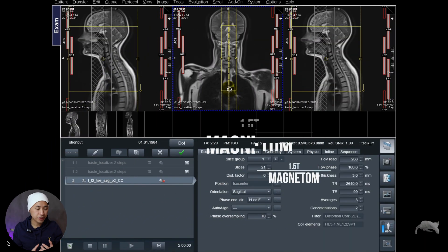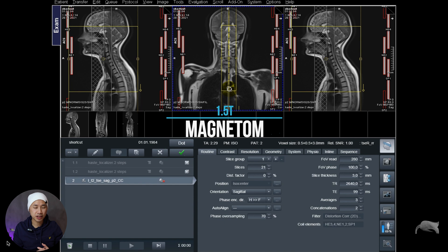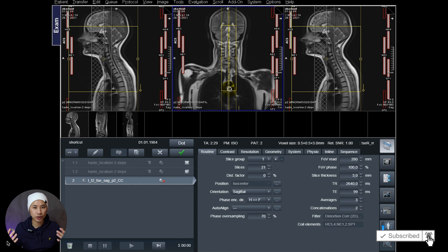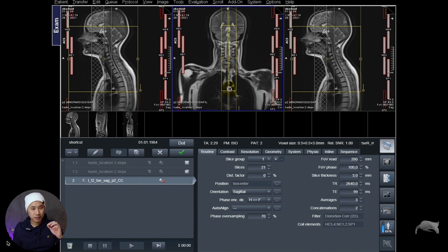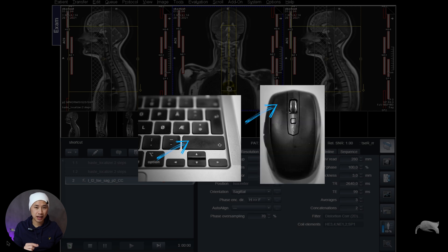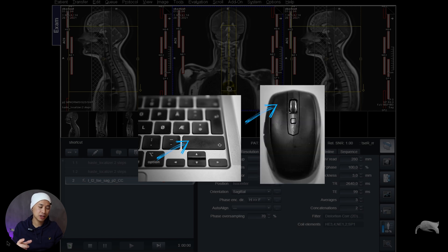We are currently at a 1.5T scanner, but it doesn't matter if you're at 1.5T or 3T, old software or new software — it will work. The most important key on your keyboard is the Shift key combined with the left mouse button.